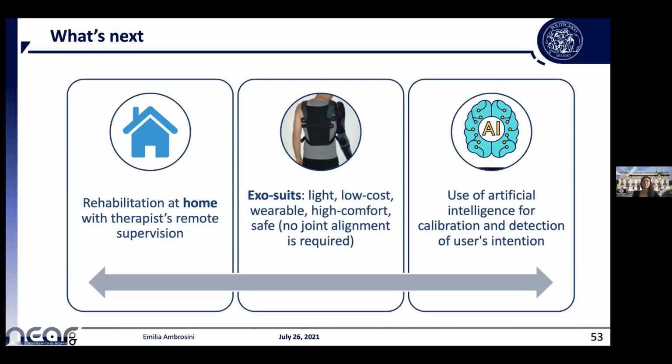So what we really need to work on from an engineering point of view is to try, and this is not that easy because usually these two communities are separated. There is a very strong robotic community, and then there are people working on FES. So it's not easy to combine these two technologies at a low level. We should build multidisciplinary teams.